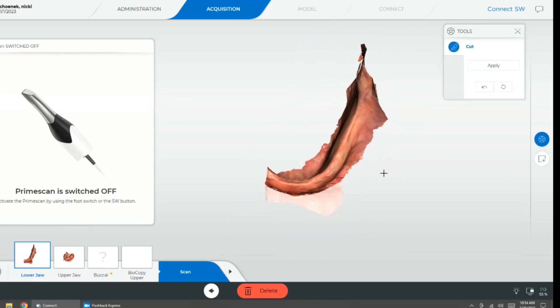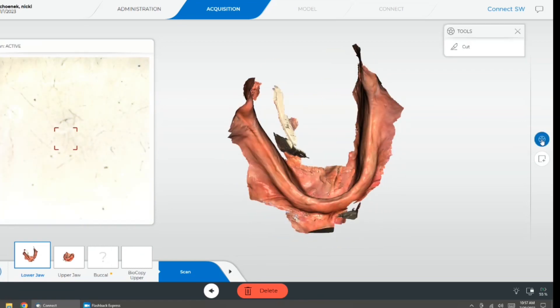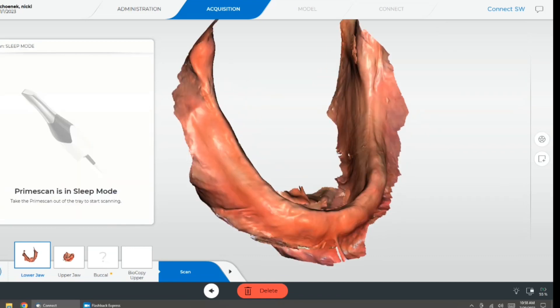And again, even on the lower dentition, using special retractors, we're able to get the retromylohyoid fossa and two-thirds up the retromolar pads to ensure that we're going to have a stable and accurate fitting denture.